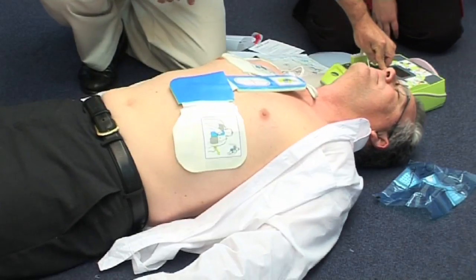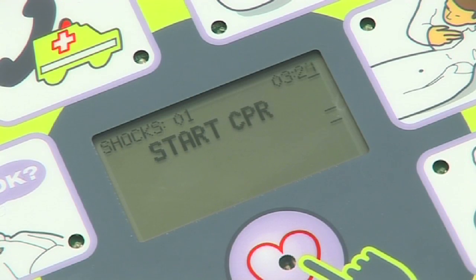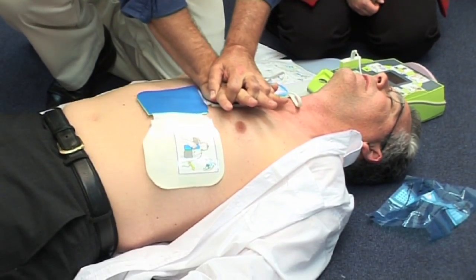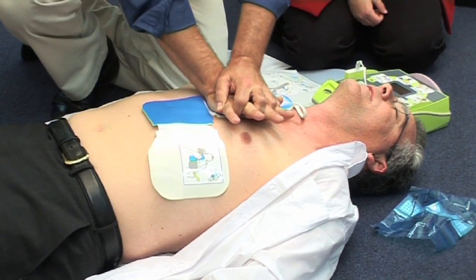As soon as the shock is applied and any convulsion has ceased, cardiac compressions are to be immediately restarted. Compressions are to be continued until the patient recovers, until other medical assistance arrives, or until the AED determines a further shock is required.